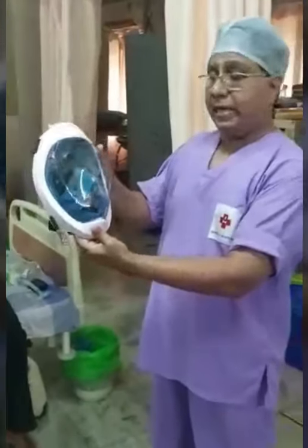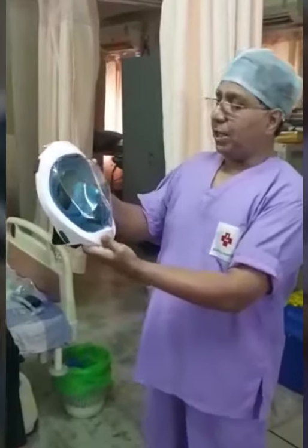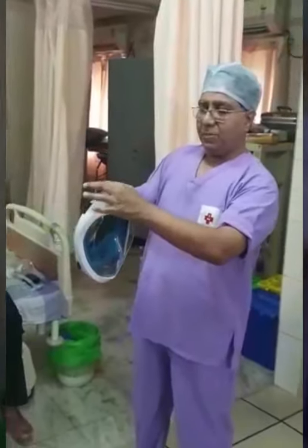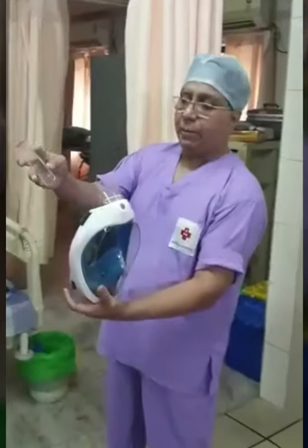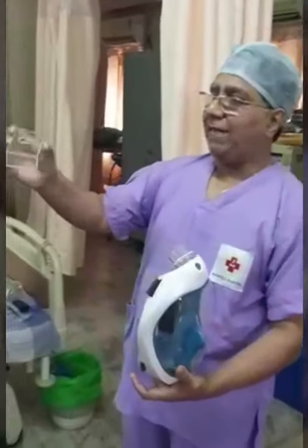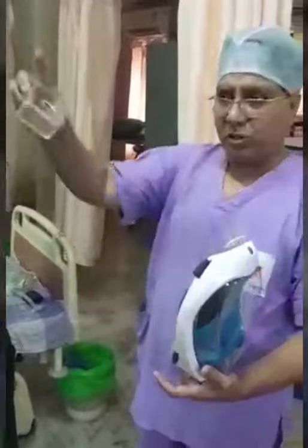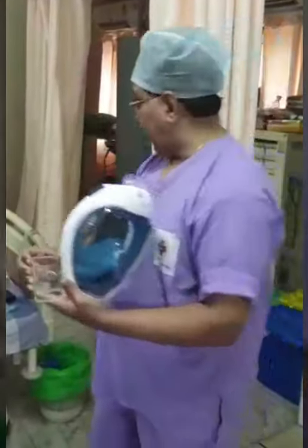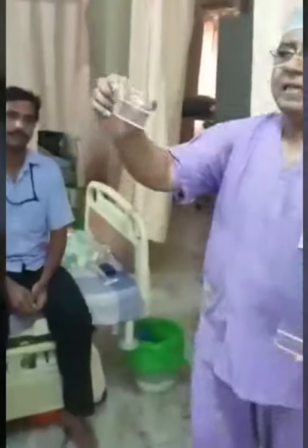Now, I am going to explain how we can use an ordinary snorkeling mask. This is a snorkeling mask provided by the Decathlon company. It comes with a fitting here, which you can easily remove. What I have made is two types of connectors to the snorkeling mask: one is a single port connector, and the other is a double port connector. Both have their own uses.